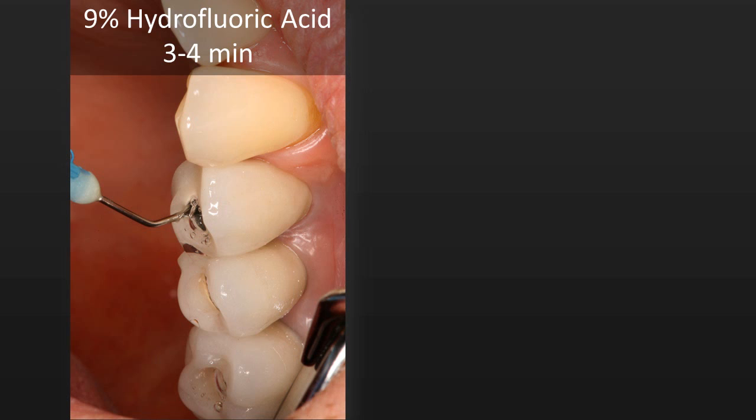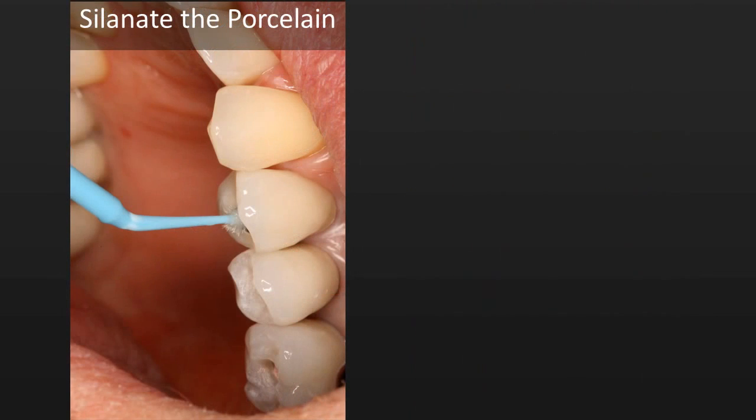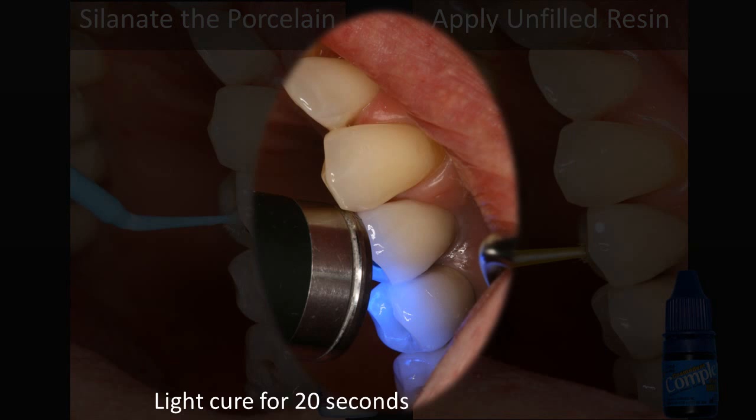After we've placed the gutta percha, we're going to etch the porcelain with hydrofluoric acid — a nine percent hydrofluoric acid from Cosmodent, called their composite etchant, which is actually a good porcelain etch. We apply it for three to four minutes, then rinse and dry thoroughly. Next, we're going to use a silane — the Silinator by Cosmodent — applying multiple coats and leaving on for about a minute, then air drying. This is followed by an unfilled resin, the Cosmodent Complete, which is our adhesive for the composite. We place a thin coat, air thin, and light cure for 20 seconds.